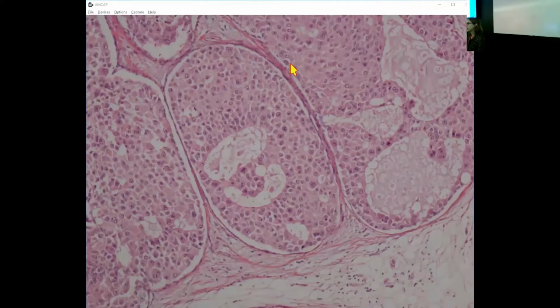But for low grade lesions, you still want to see nucleus size variability, but they're still going to be kind of round and regular, I guess. I look for architecture. Is there really good cribriforming that I'm sure is atypical? I'd want it to be somewhat extensive. And if it was just limited in extent, I guess I'd probably be descriptive. In the setting of core needle biopsy, you'd probably want an excision.